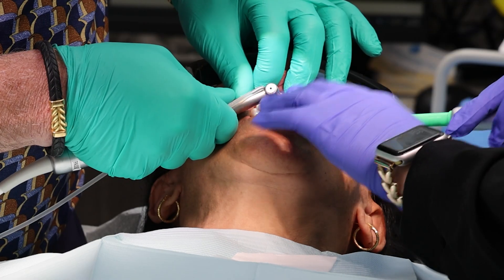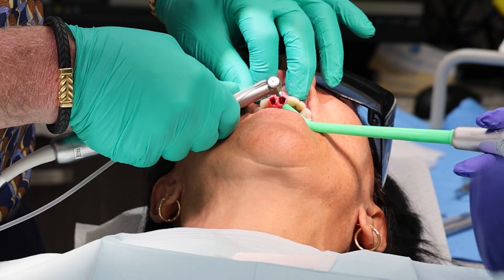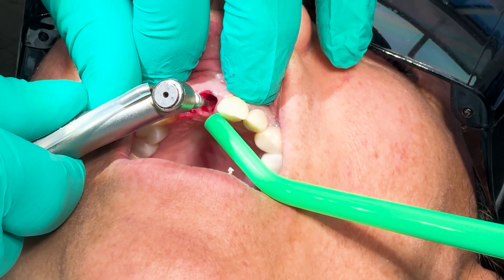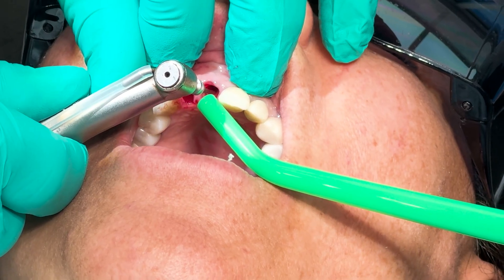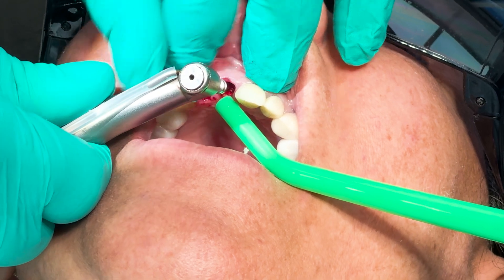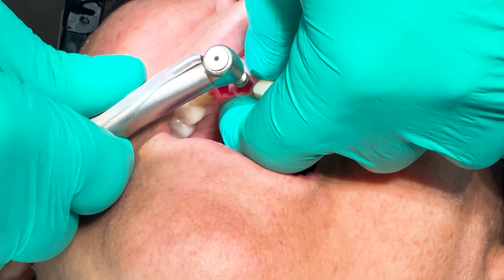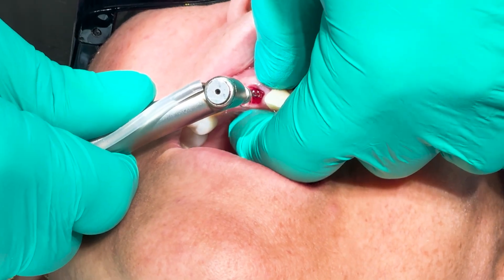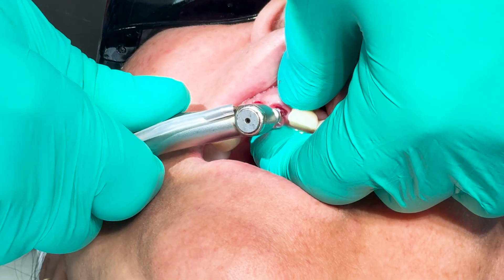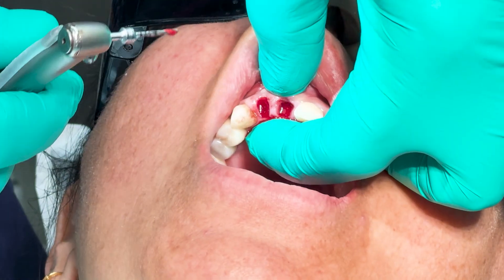I'm going to start with the number eight implant. I'm angling this a little toward the palate using my 1.5 millimeter pilot drill with a little palatal angulation. I'm feeling the inside of the palate to make sure that we're not going too far palatally. I'll need a surgical suction, please.